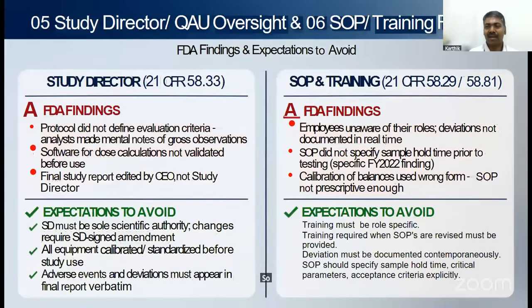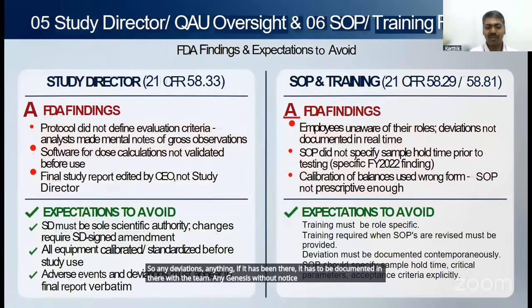So any deviations, anything, if it has been there, it has to be documented in the verbatim. Any changes without notice of the study director should not happen in the report also.